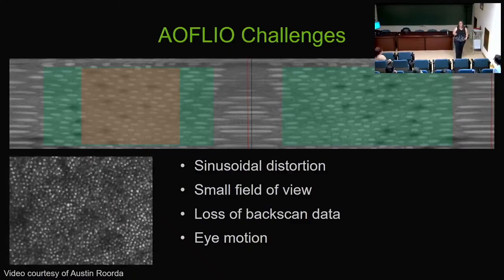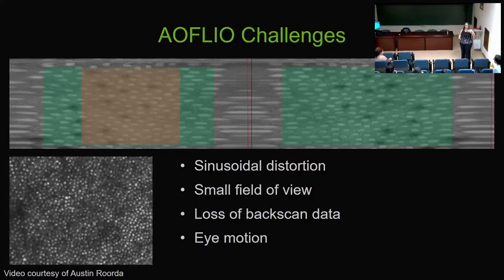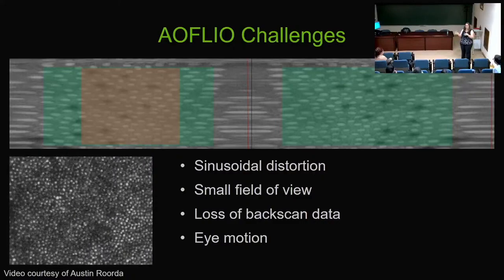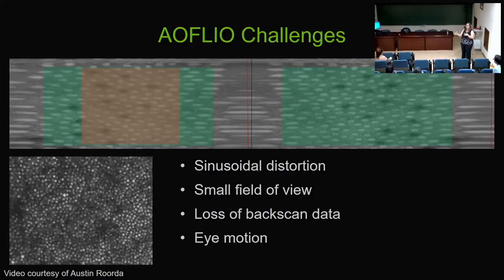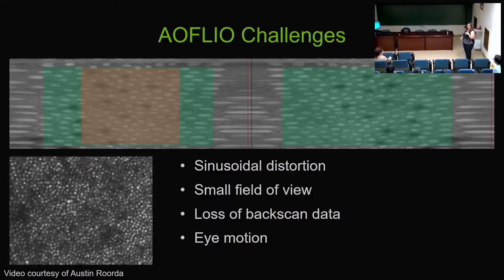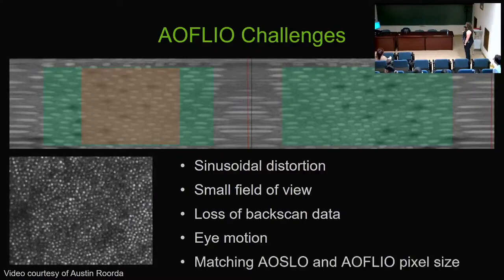Typically, we would take the reflectance image, look at the motion in the reflectance image, and apply that to the intensity of the fluorescence images and create intensity images that have been shifted to compensate for the motion seen in reflectance. We were unable to do that until recently with the FLIM data.